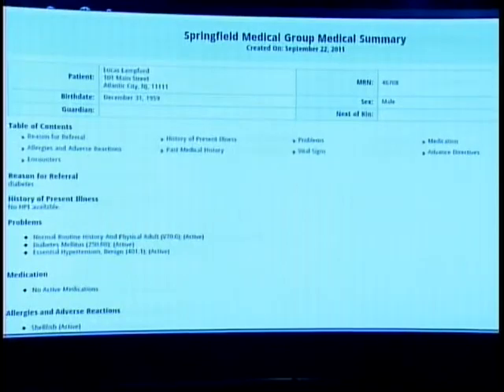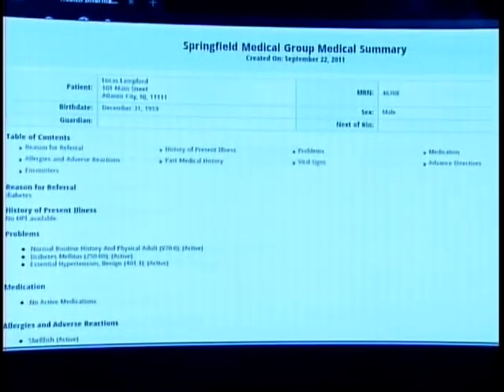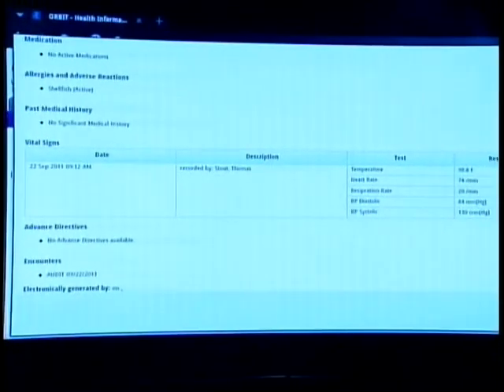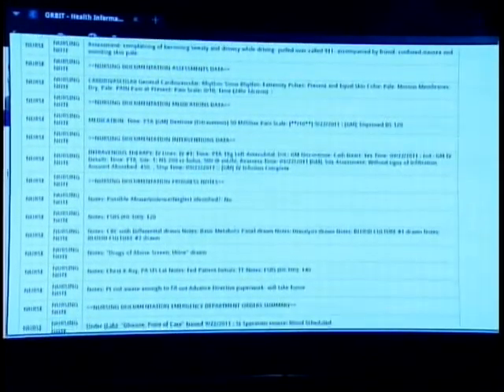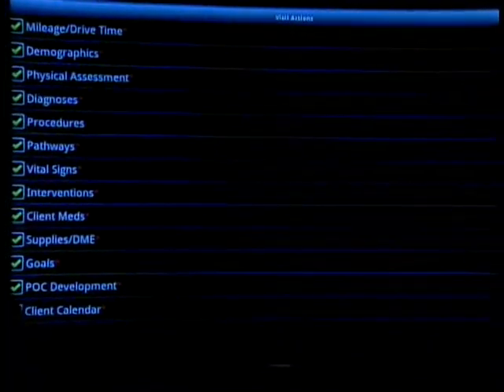And next I'll be able to see what he uploaded. Primarily looking for things like medications if I can. Okay, I don't see any here. Let me see if he's got anything here. Nothing there. And one more. And this is the ED. And the ED says, I'm looking for something to add to my document for you. Glyburide oral. So I'm going to go from here into my software, which our nurses use in the field, and I'm going to edit the meds.